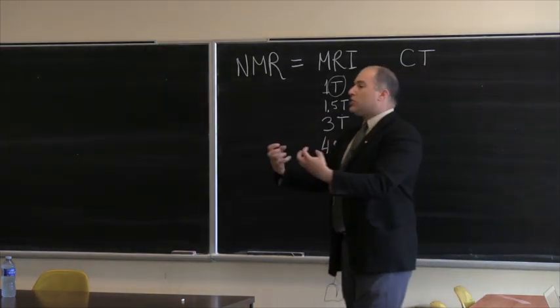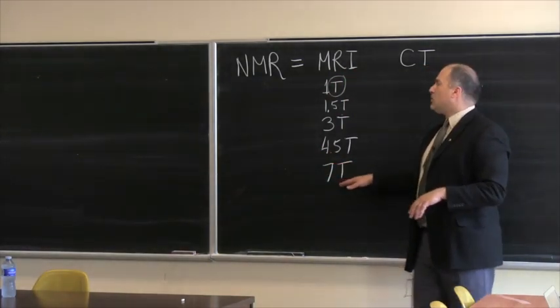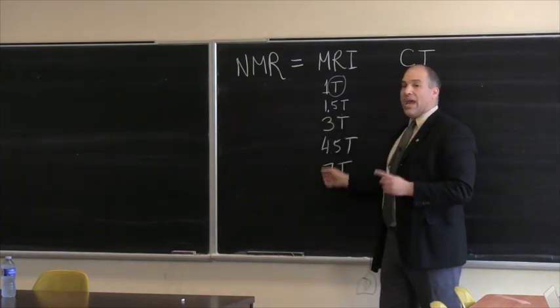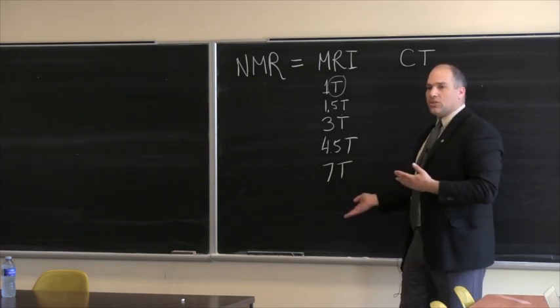So when University of Minnesota had the 7 Tesla, to them it was more of a technological achievement to create a magnet that has a magnetic field of 7 Tesla. We will use it mostly for animals. Today, the 7 Tesla that was used for animals at Minnesota is used at McGill for humans. It's being built right now. So you can see the times are changing.